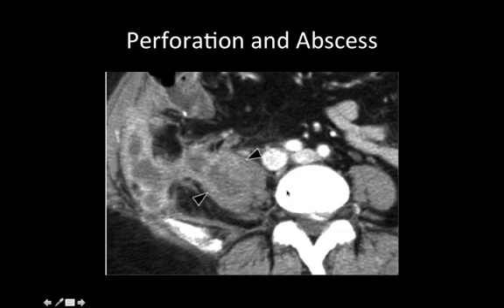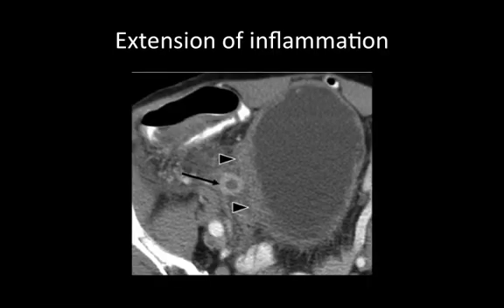This brings up an important point. Here we have an appendix which is fluid-filled, thick, with a fuzzy wall and fat stranding. What else do you see? The bladder. Notice the asymmetric thickening of the bladder wall on the left — don't mistake this for cystitis. In this case, it's much more likely that the adjacent inflammatory changes in the appendix are causing the bladder wall to be thickened.